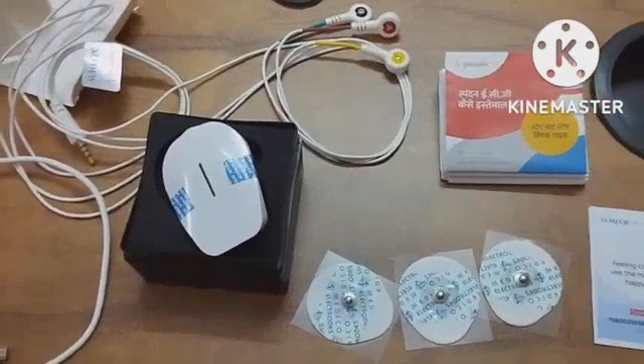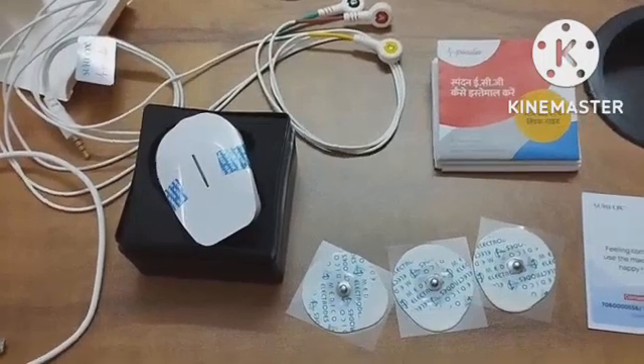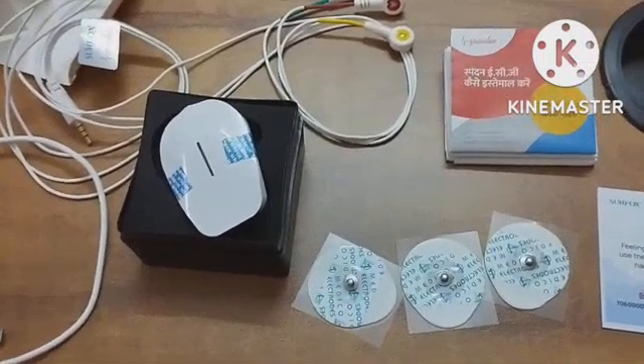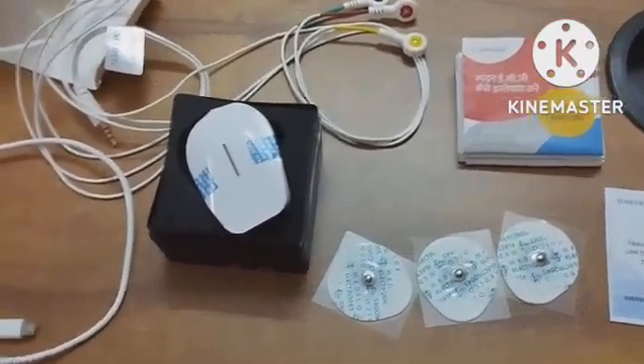This is an AI-based machine and it claims to provide 99.7% accuracy in diagnosing heart conditions or ECG readings. This is a Made in India device and will cost you around 7,000 to 8,000 rupees.